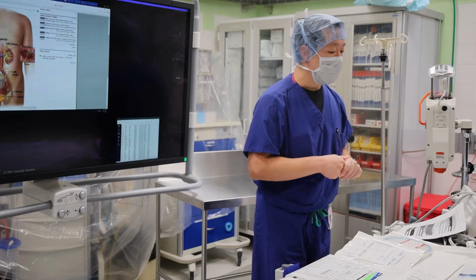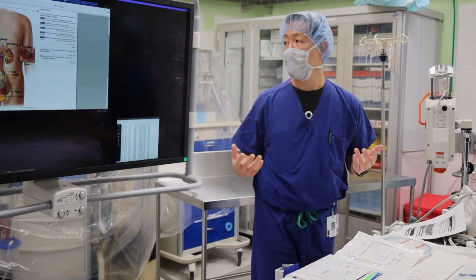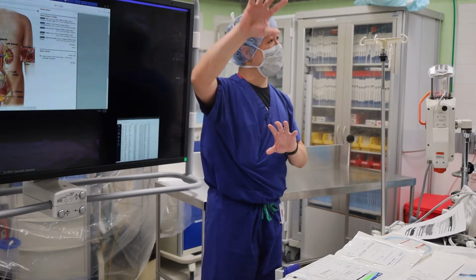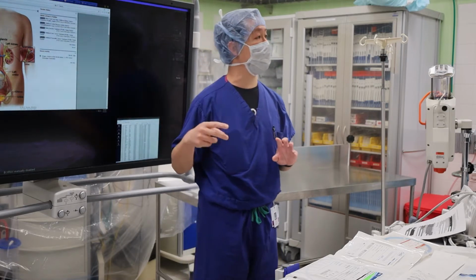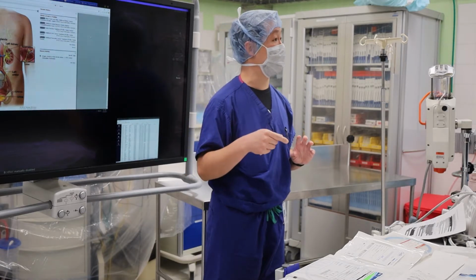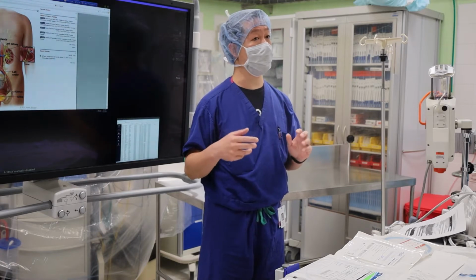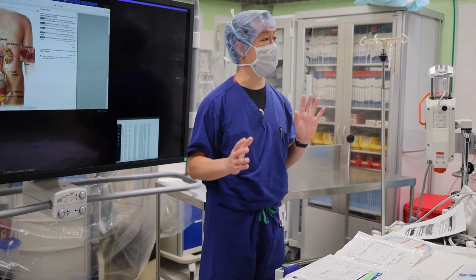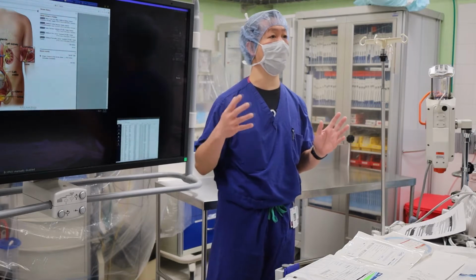In a certain percent of people, because of the way you're made, you have more than one collecting system on both sides. You can have an upper pole moiety and a lower pole moiety. You can have two ureters. When somebody has complete duplication of two ureters, they oftentimes don't both insert onto the bladder. So somebody might be draining urine from somewhere close to the bladder, and that's what they've always known. And then urology can't always figure out why the stent is not going in the part that's obstructed. Well, it's because you actually never were in the other ureter.